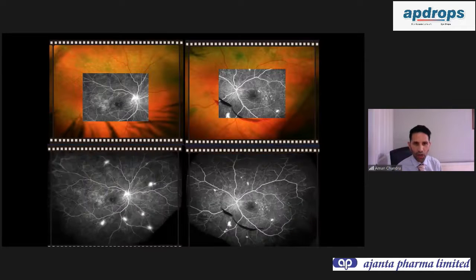However, with wide field imaging, you can see immediately, even in the right eye, there are lots of areas that you may not have spotted with the clinical examination or even with the standard fluorescein angiography. You can see these areas here of leakage, indicative of proliferative retinopathy, even in the right eye. In the left eye, we are not surprised to see lots of areas of neovascularization because we saw the pre-retinal hemorrhage. Very useful, therefore, particularly with diabetic retinopathy, looking for peripheral changes.